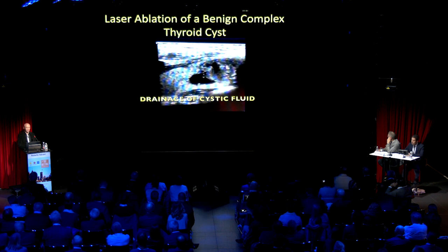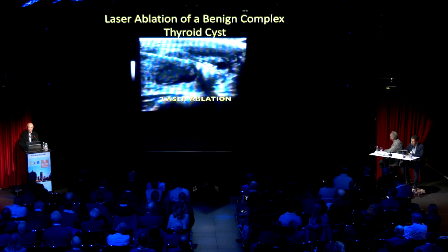And after that, the needle was repositioned, and the second part of the cyst, or the pseudocyst, was drained. And then the laser fiber was inserted into the needle, and the laser was fired.